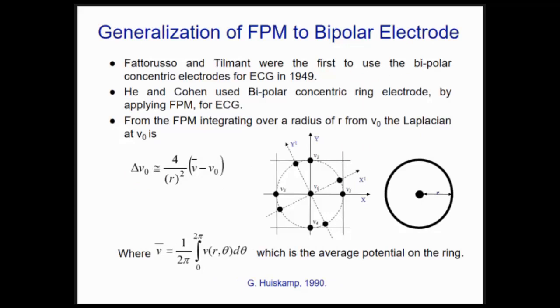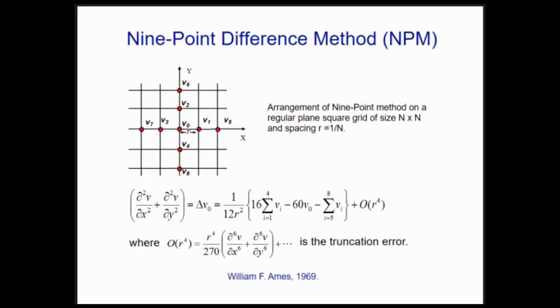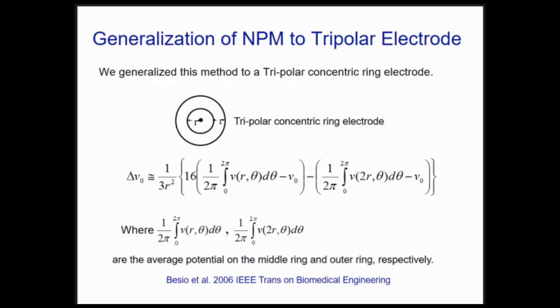If you rotate those electrodes around infinitesimally small amount, 360 degrees, you end up with a ring and a disc, bipolar, which is significantly better than just using disc electrodes, but you can't get a PhD doing that when somebody's already done that. So if you add more electrodes and get another difference on that, then it's more complicated. And we see that the higher order terms here, truncation terms, are of the fourth order, which gets us closer to the Laplacian than the single ring.